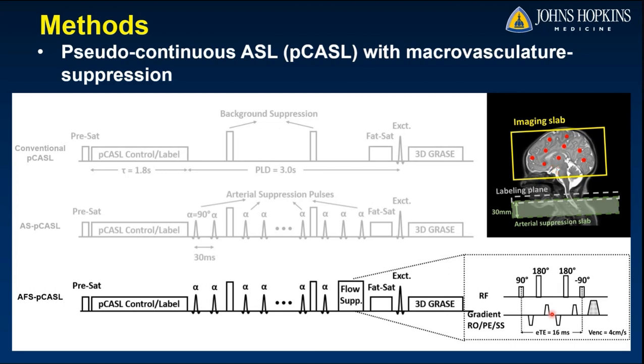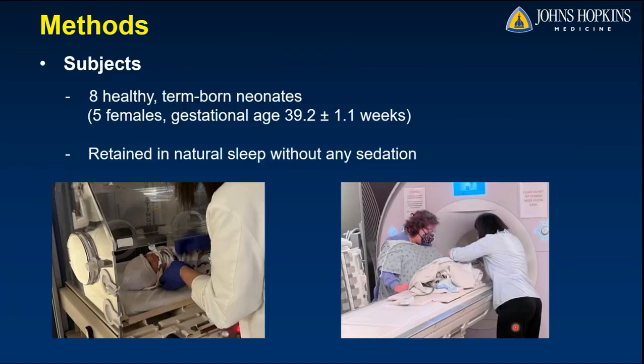We have tested these 3 sequences on 8 healthy term-born neonates. During the scanning, the baby remains in natural sleep without any sedation throughout the whole 1-hour research-dedicated scan. This picture shows the experiment setup of our baby experiment. Just in case you cannot see, this is the small little sandwich that we want to image.